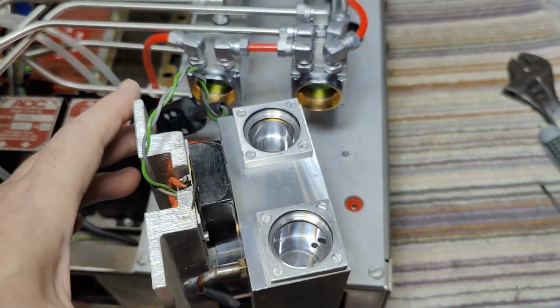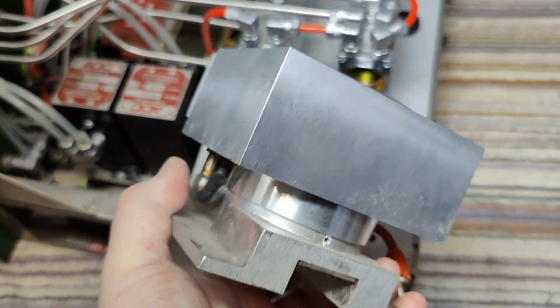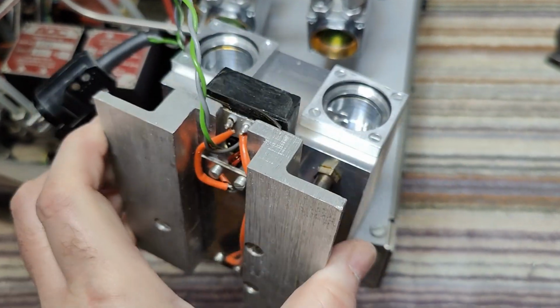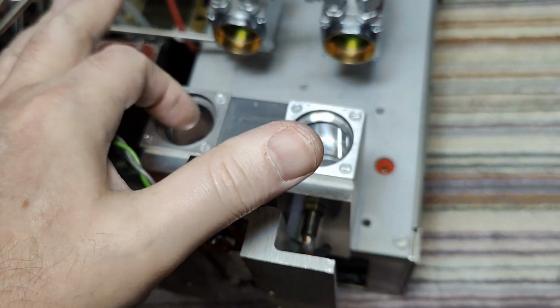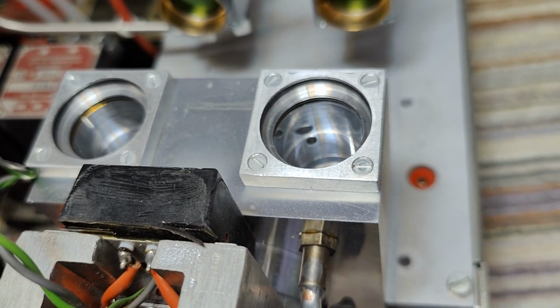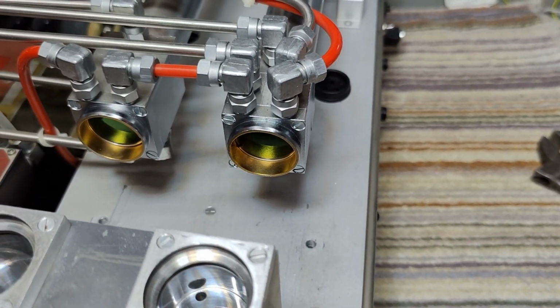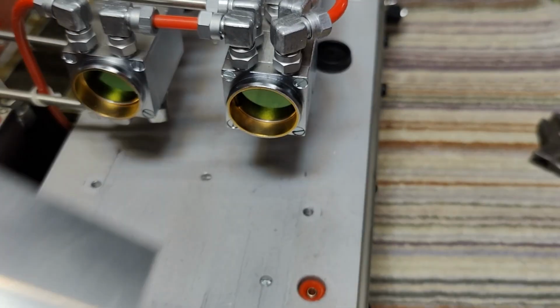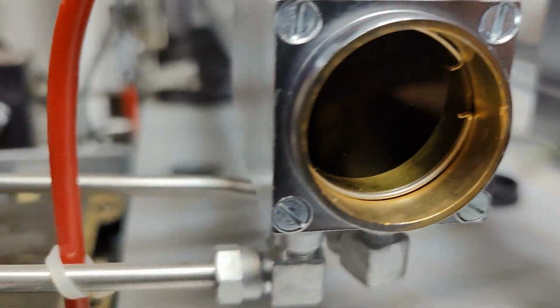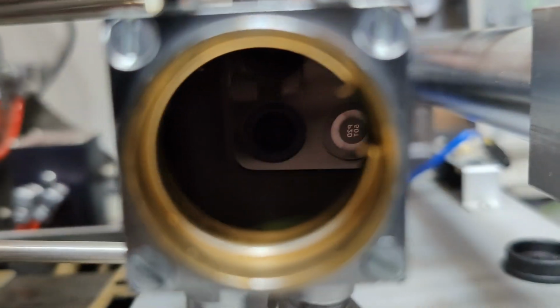It is getting more and more interesting. So here is the fancy smancy detector unit. And look at that, we got glass here, and this is totally pressure tight. And here is the something that transmits the infrared from the emitter. And we've also got some, I don't know, can we see through here? I don't know if we can see through here. Let me turn the motor now.